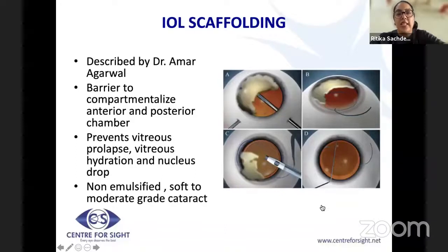Now, moving on to the next case. Fortunately, in both these cases, you have had only soft cortex to deal with. What would you do if you have a large heminucleus still remaining? You don't have a posterior capsule, so this may drop back into the vitreous, and that is a complication that an anterior segment surgeon can't handle.